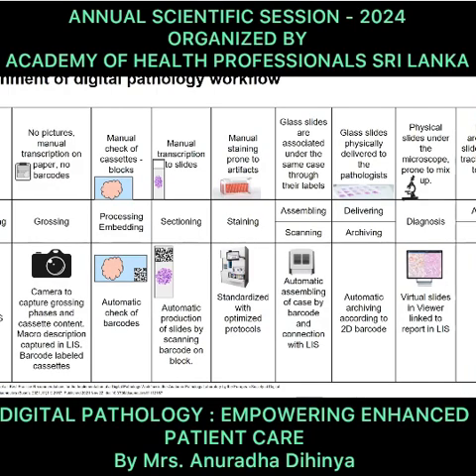Now, if we look at the histopathology lab, there are many manual processes involved, and in those manual processes we are not seeing that things have been barcoded, nor have they been LIS integrated. But now many hospitals and labs are approaching digital pathology, and the first thing they realize after buying the scanners is that there is a lack somewhere in the LIS integration piece. And with that LIS integration piece coming into the picture, the histopathology workflow is also getting digitalized.